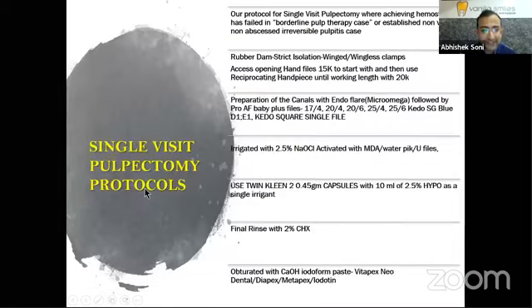So that's the single visit pulpectomy protocol, wherein we are following a hybrid technique. We start with a 15K file. We usually don't need the 10K files because the canals are already wide in a young primary molar. Once hand filed until a 20K file, we shift to our Endoflare, followed by our ProAF Baby series, which I like. Dr. Paul follows Kedo-SG Blue files.